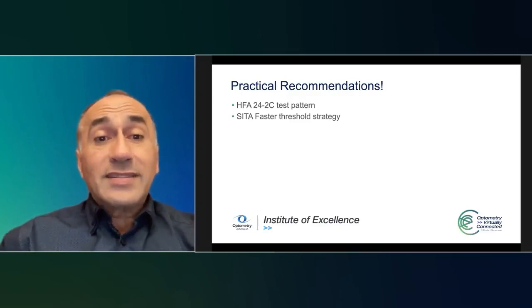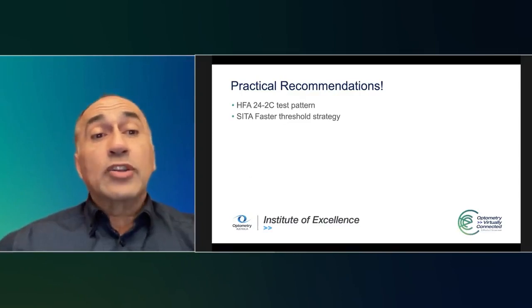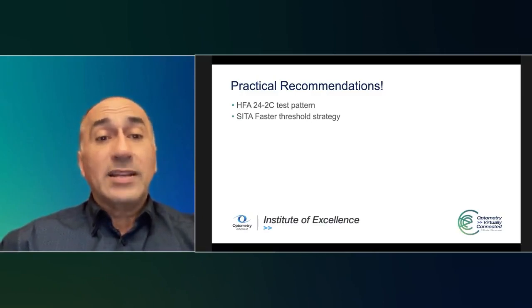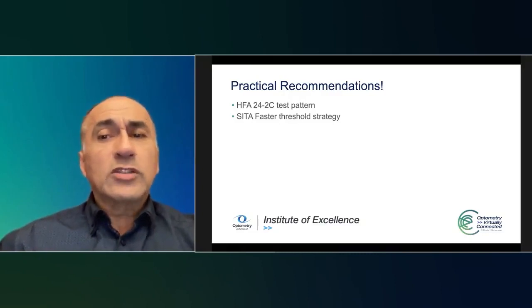Use the SITA Faster strategy. That's the one that can finish in 90 seconds to 2 minutes. In practice, I find the 24-2C takes about 2.5 minutes in a person with glaucoma and about 2 minutes in a glaucoma suspect or someone with a near normal visual field. So they're my real world times, about 2 to 2.5 minutes, which is tolerable per eye for most patients.